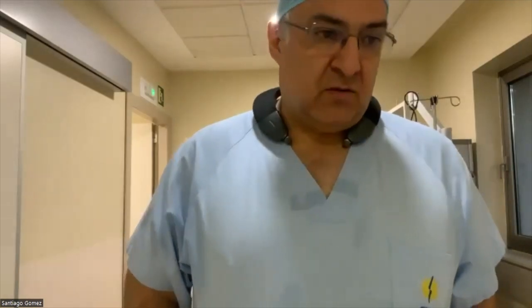I agree. I concur with you. I think HoLEP is based on understanding the anatomy. People who have been doing TURP during their lives never saw this plane the way we see it here. If you understand the anatomy and you get some experience with it, then the tool is less relevant. And I have to say that thulium fiber and pulse thulium lasers provide even better hemostasis than holmium, I think. Yeah, true. Which is an advantage on the other side.